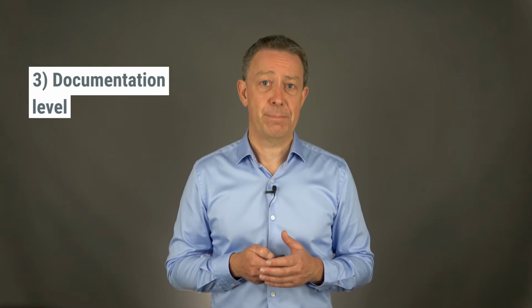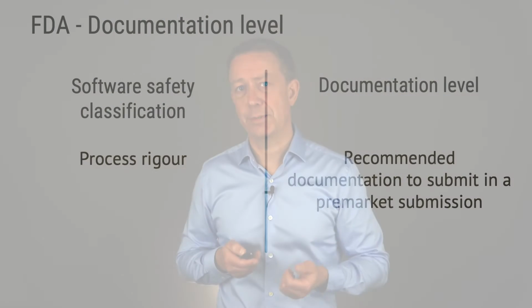And if one software classification isn't enough, there is also something called documentation level. This term comes from the US and the FDA, and as in the case of software safety classification, it is based on how harmful your software can be. But the software safety classification and the documentation level address this matter from different directions.